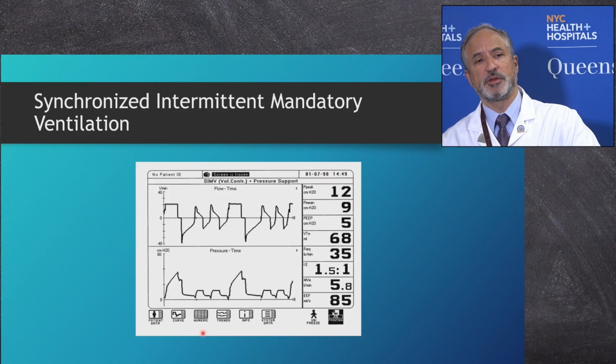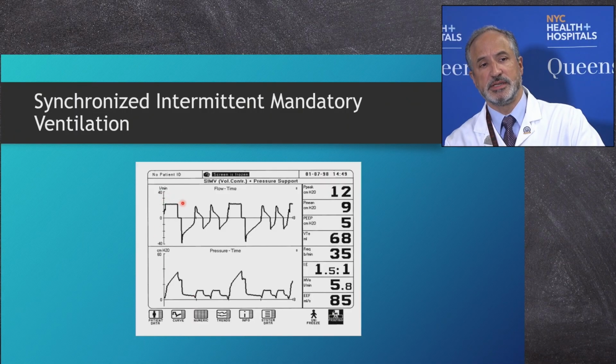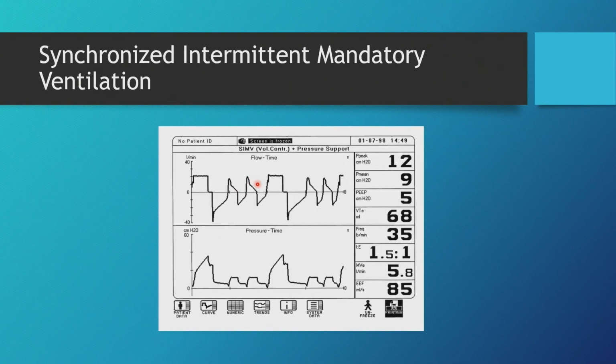And this is what the waveform looks like. This is a mechanical breath. You can see it's identical and identical. And here we can see that these are spontaneous breaths. Right? And you can see where it's triggered, the negative deflection before the breaths.